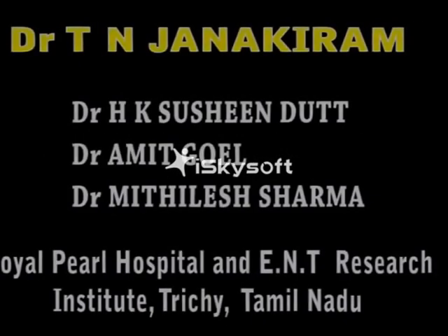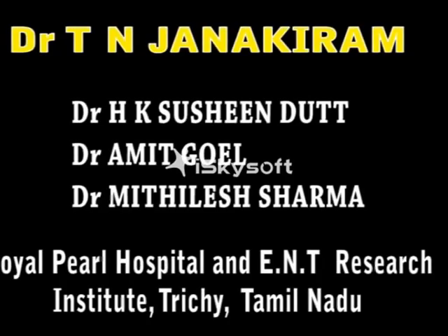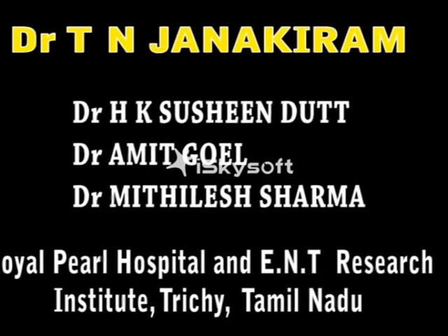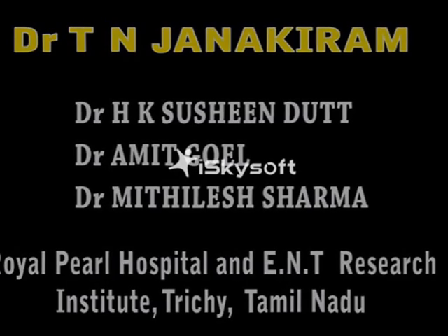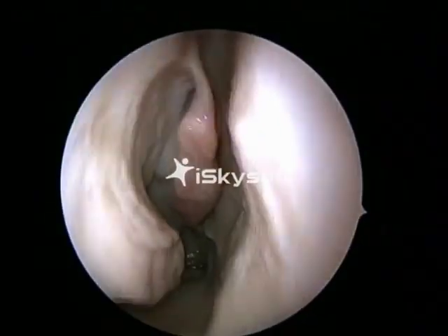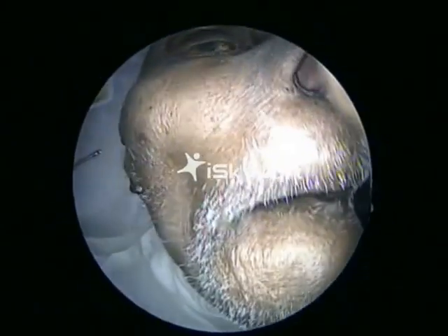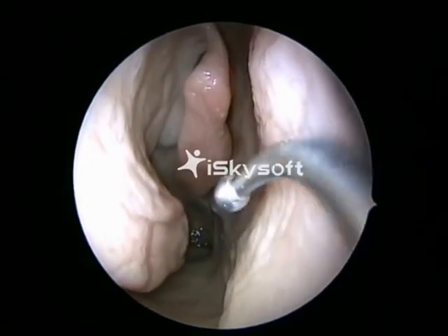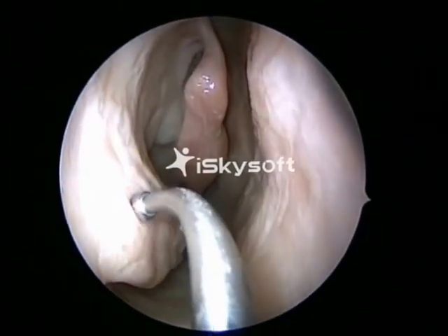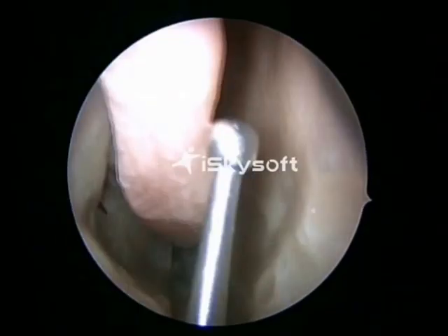I am Dr. Janakiram from Royal Pearl Hospital and ENT Research Institute, India, and I have done this dissection along with my residents. We start with a diagnostic nasal endoscopy using a 0-degree telescope, and this is the aircraft technique.